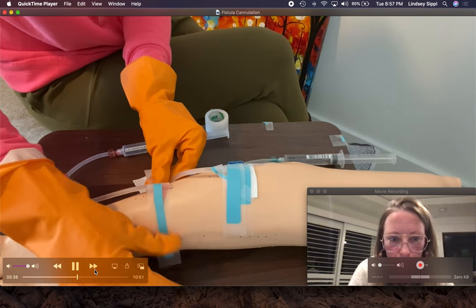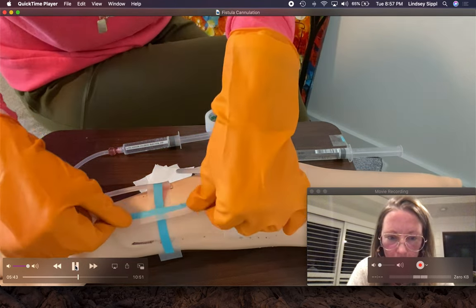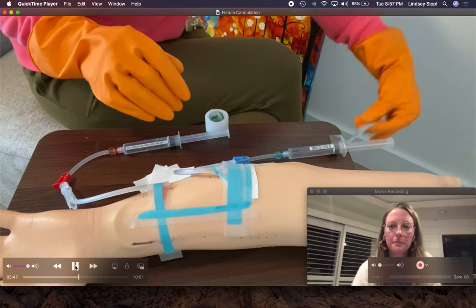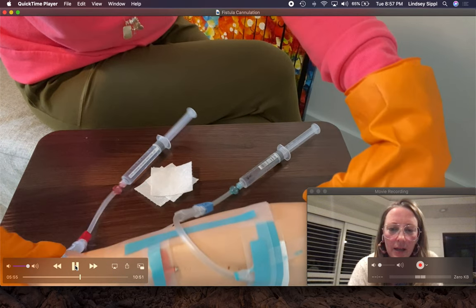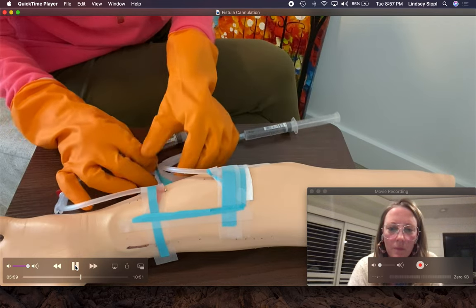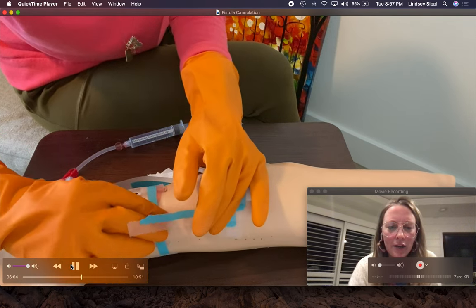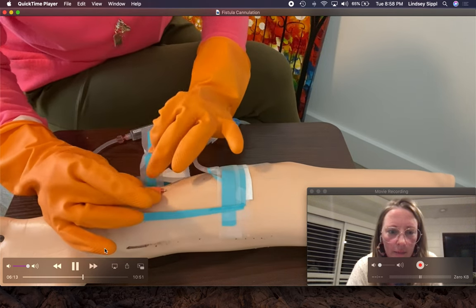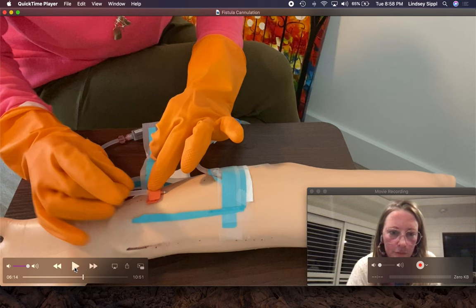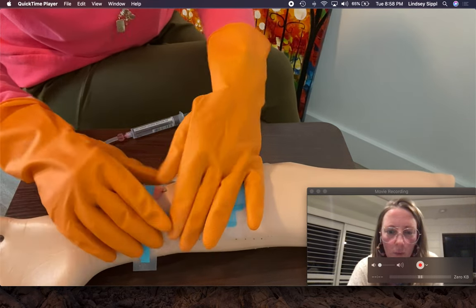Next I'm going to do the H method. I put tape on the sides but not over where the needle goes in — keep that clean, no tape over that site — and then I just make an H. Taping is like art. You might also hear the phrase 'flip a wing' in the clinic. If you're not getting great pressures on the machine or a good blood flash, you literally place the wings on top of each other. That changes where the needle sits inside and helps pull the blood easier — it gets it off the wall of the fistula.